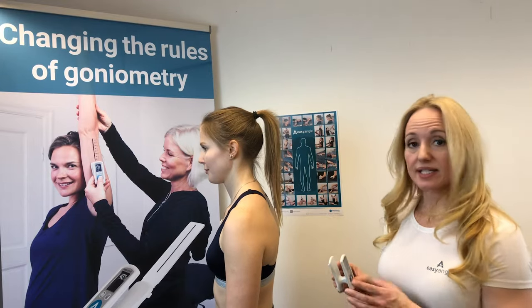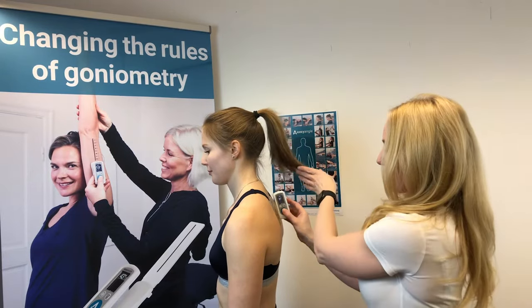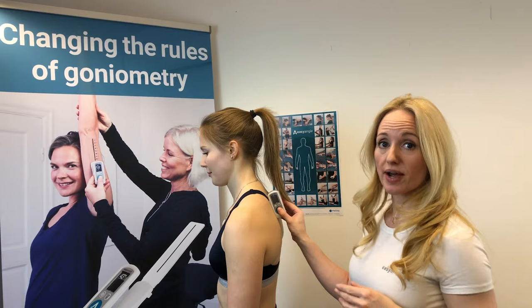We press the button so that we get our blinking zeros, and that tells us we're ready to set the plane in which we want to measure. To take this measurement we're going to align the device with the top of the thoracic spine.